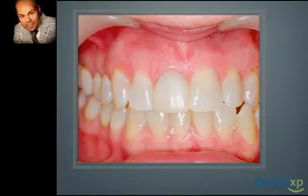In my personal experience, I always tend to bone graft the socket and cover with a collagen plug, and either immediately temporize or place a form of transitional interim prosthesis. However, I found that whenever I grafted these areas, there would still be a slight depression of the tissue and volume loss at the free gingival keratinized margin compared to the adjacent tooth.